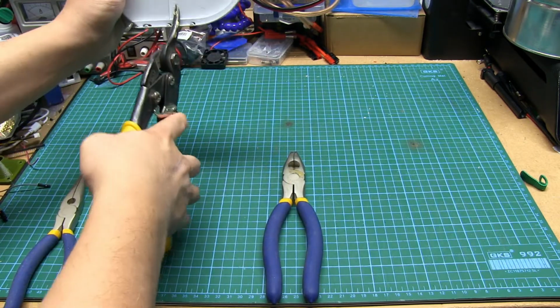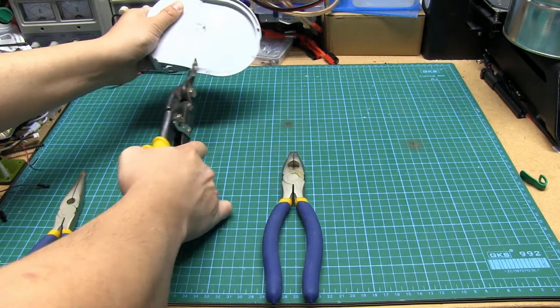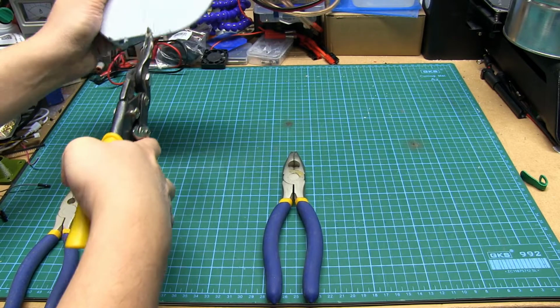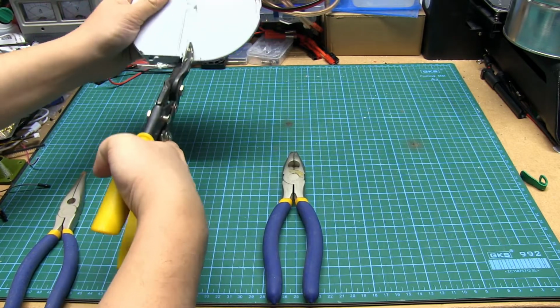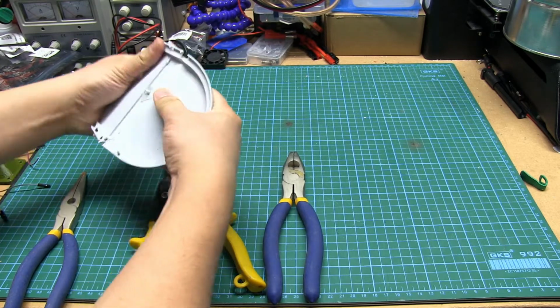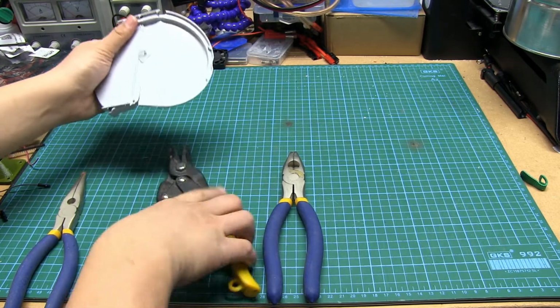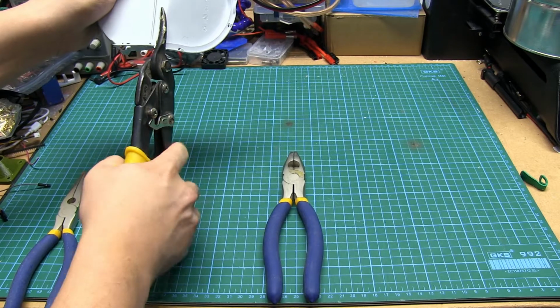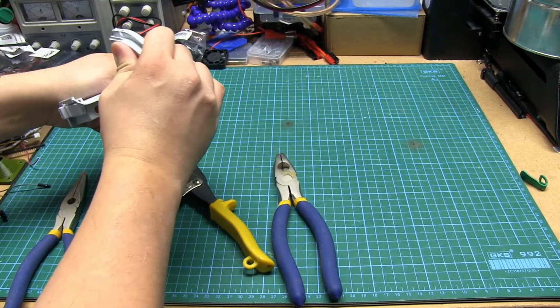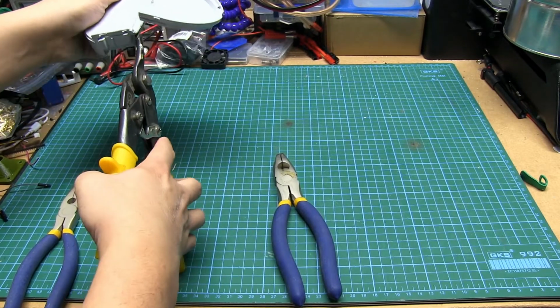Either way, let's try and bust into this. Using these tin snips is actually surprisingly strong plastic. But we're gonna just bust into here like nobody's business.